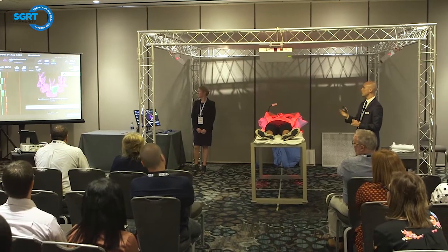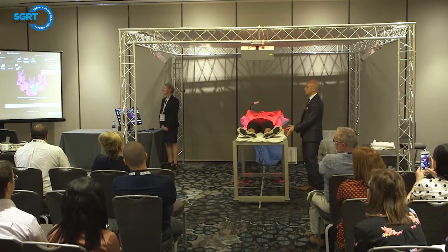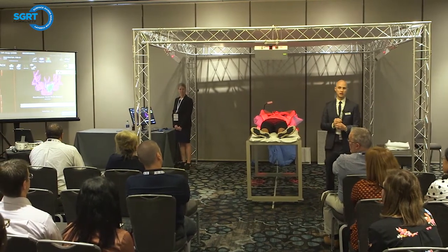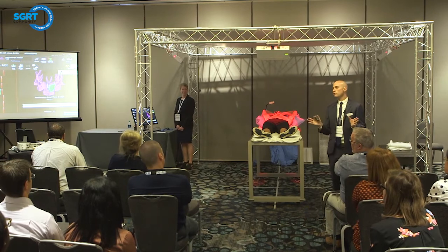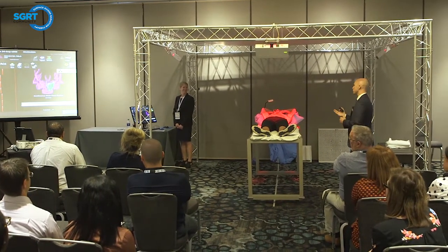Once everything is in green and he's as close to 0 as possible on his vert, we can, if we need to, adjust the lat and the longe just with our translational couch movement. We don't ever want to move the vert because that's just going to be based on the patient amplitude. Okay, so the patient can go ahead and breathe.